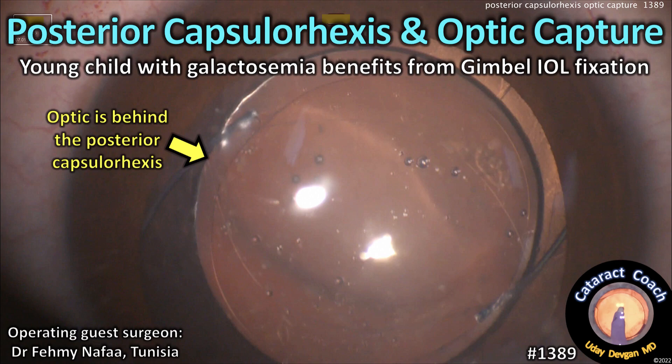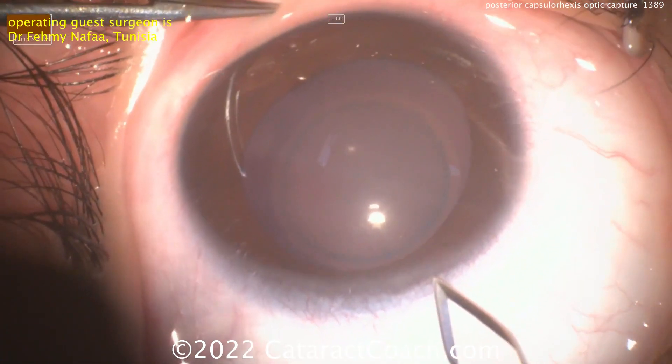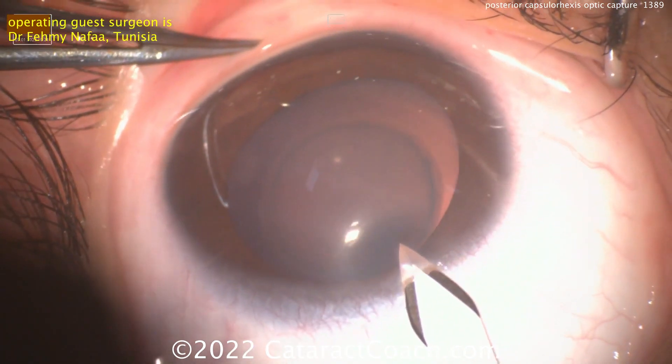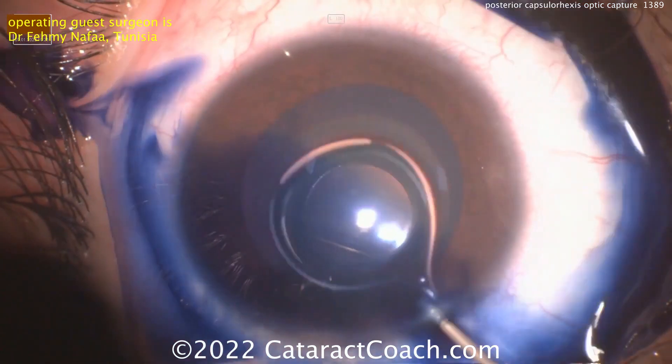CataractCoach.com — Posterior Capsulorexis and Optic Capture. We've got a young child with galactosemia who benefits from Gimbal IOL fixation. Our operating guest surgeon here is Dr. Femi Nafa from Tunisia, and this is a young child with this cataract.